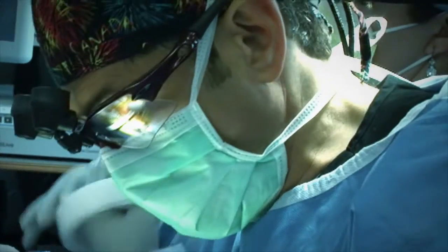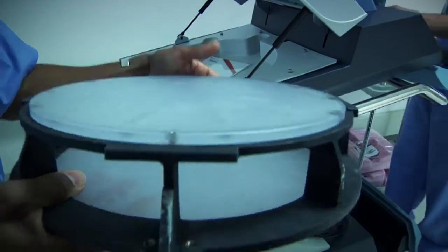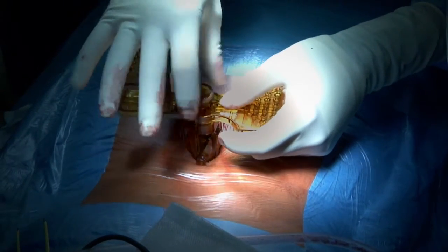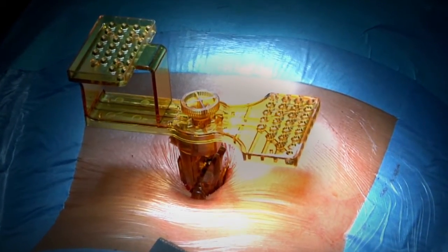Once the mounting platform is in place, we are ready for the next step. To execute the CT-based surgical blueprint, it is necessary to match it with the patient's spine and the mounting platform attached onto it. In order to indicate the mounting platform's spatial location on fluoroscopy, a 3D marker is attached onto it.